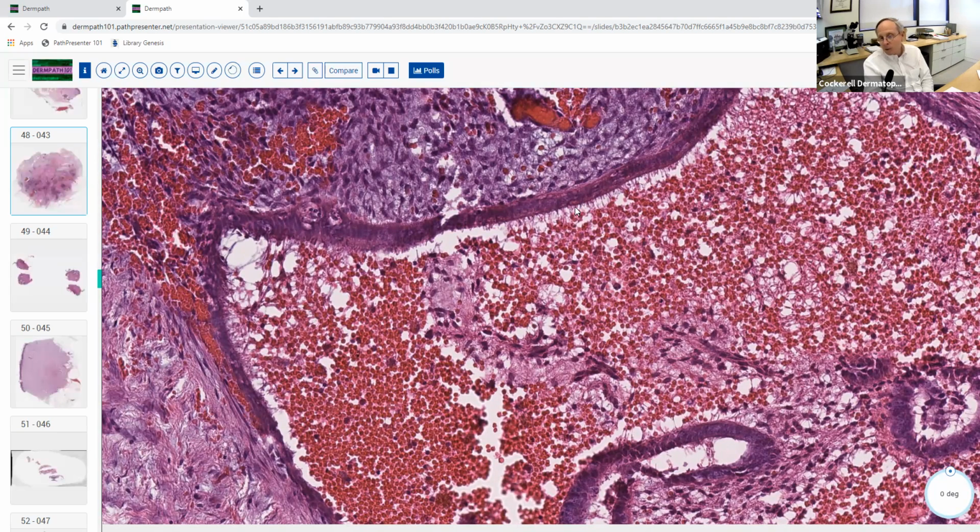It's clearly not a hidrocystoma. You guys know what that looks like. It's not a median raphe cyst. That's usually seen down in the penile area. And it's also lined by urothelial epithelium. It's not lined by this kind of epithelium. And then cutaneous ciliated cyst.